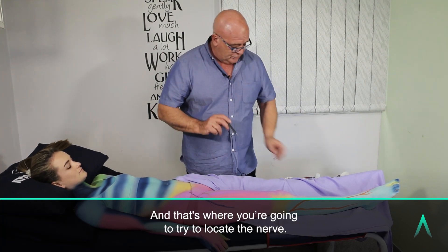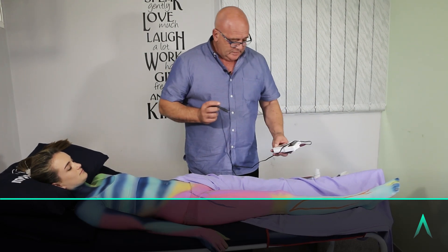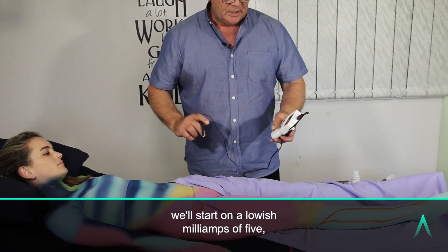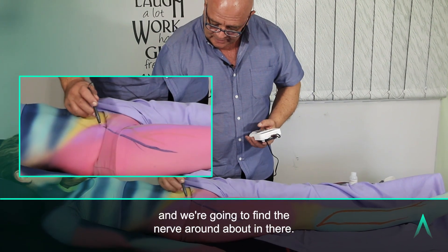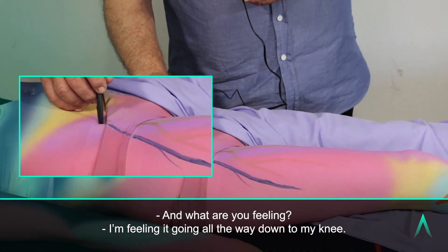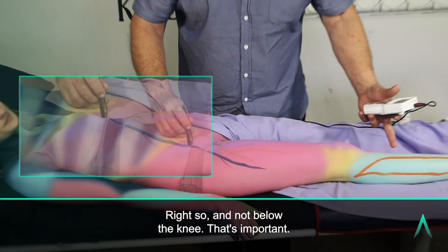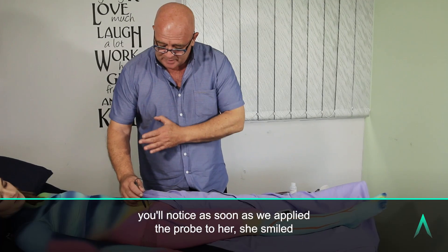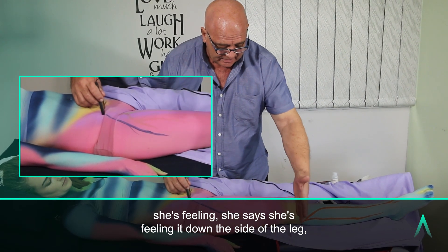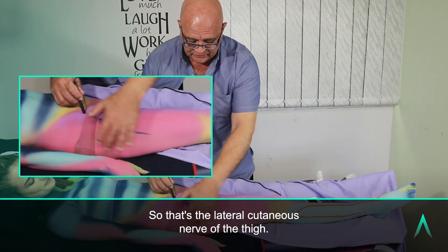That's where you're going to try to locate the nerve. We'll put a little bit of conduction gel on the tip of the probe, start at a low milliamps of 5, and find the nerve around about in there. What are you feeling? I'm feeling it going all the way down to my knee. So not below the knee — that's important. She smiled as soon as we applied the probe; she's feeling it down the side of her leg, down to her knee, but not below the knee. That's the lateral cutaneous nerve of the thigh.